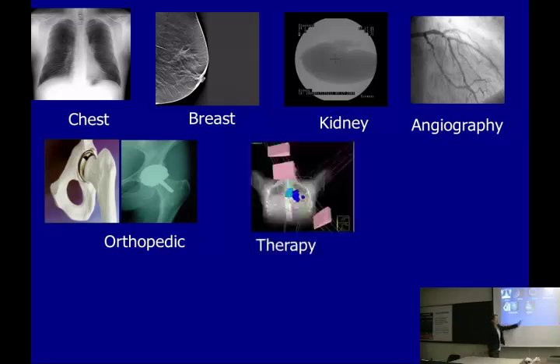Therapy, image-guided therapy, is also a very interesting field. For traditional radiation therapy, people will get a CT first to do the positioning, then send the patient to the therapy room directly. But there is also some research on image-guided therapy, or reconstruction positioning. So when the patient is sent inside the therapy room, they can do the repositioning again, to see if everything is still correct. A quick three-dimensional imaging method like tomosynthesis would be very helpful. Some research groups are doing image-guided therapy with tomosynthesis as well.